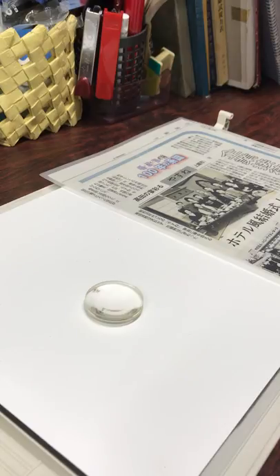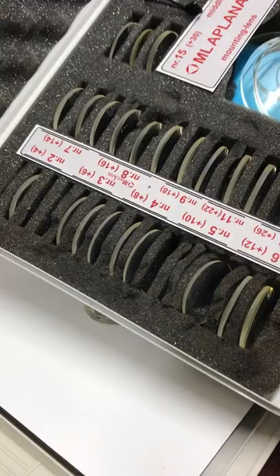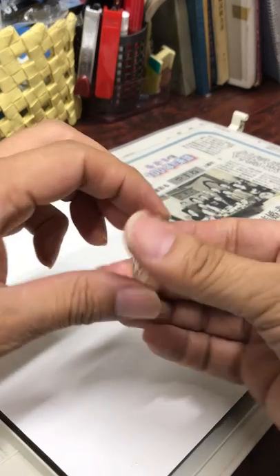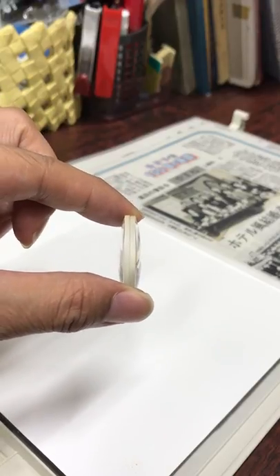Today I will explain the aplanatic lens for low vision. This is a test box of Emil Aplanat. There are many convex lenses in this set. Now I will explain about the structure of an aplanatic lens.